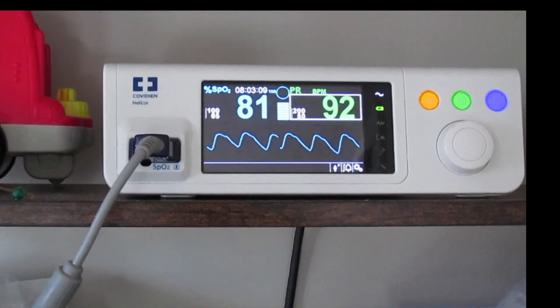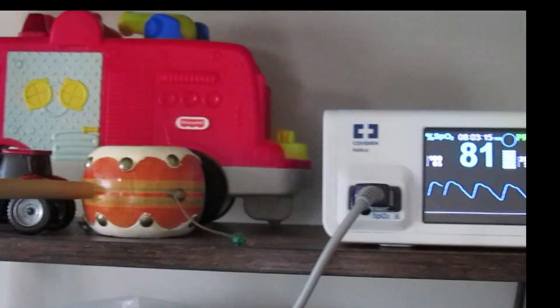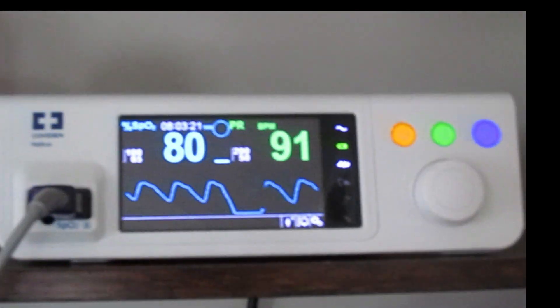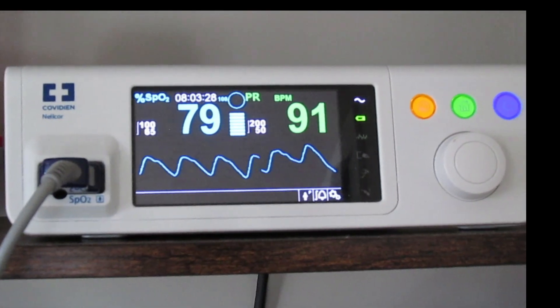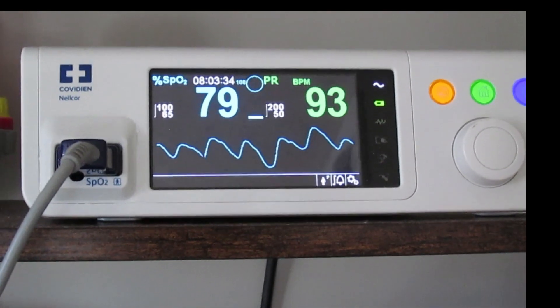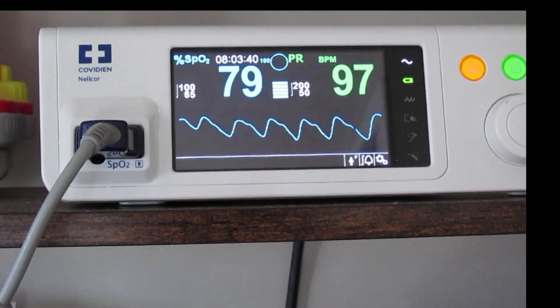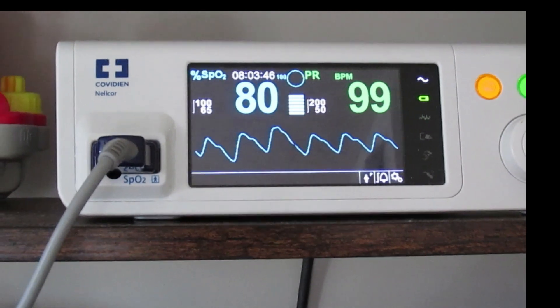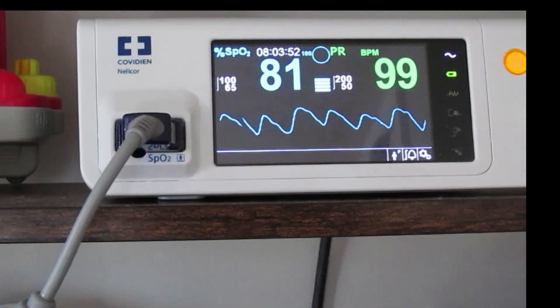We double-checked this using a finger pulse oximeter to see how good that reading is. You can use the finger pulse ox and see if it's close to what the monitor shows — if so, you know they're in line with each other and it's probably a good reading. We're reading 80 on the SpO2 here, and 79 to 80 on the finger pulse ox, with 99 on the pulse. So it's basically the same — the sensor is attached well.